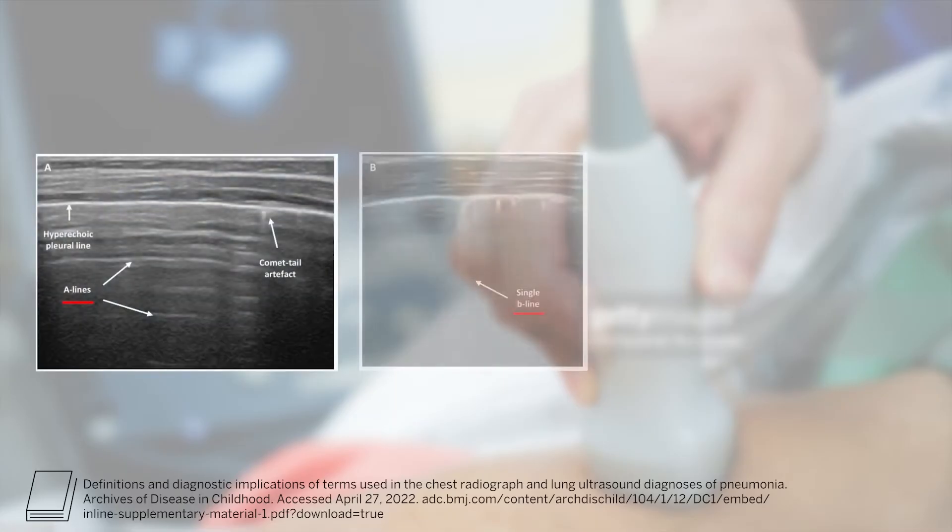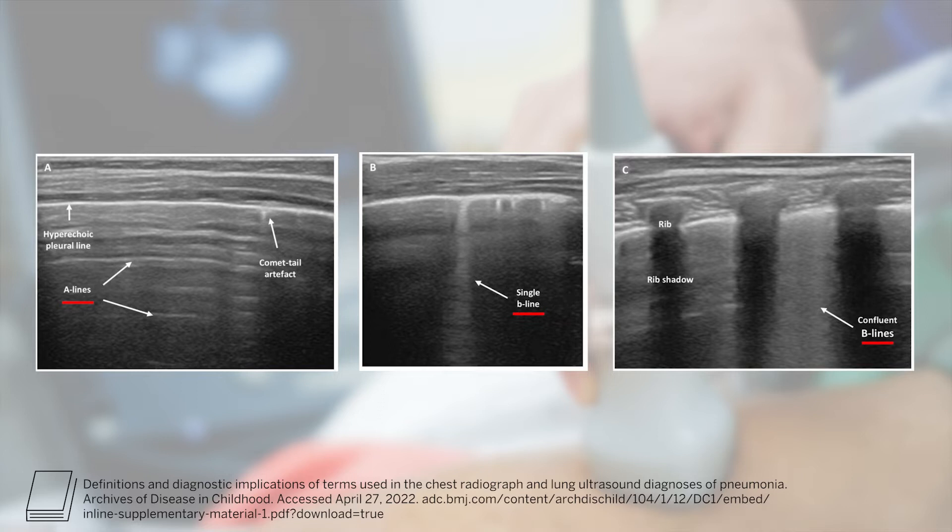If you were to go back and read an internal medicine textbook from 25 or 30 years ago, they would tell you that ultrasounding the lung is a waste of time because it's an air-filled organ, and air is inherently the enemy of ultrasound since it does not conduct sound waves very efficiently. When we do ultrasound the lung, most of what we're looking at are artifacts — things like A lines, B lines, and consolidation — which are artifactual products of the gas-solid interface in the chest. Lung ultrasound is portable, sensitive, and dynamic, and can vastly change a diagnostic picture very quickly. But it's important to remember that all findings have a differential diagnosis, they're not pathognomonic for anything, and they're part of a larger clinical picture.